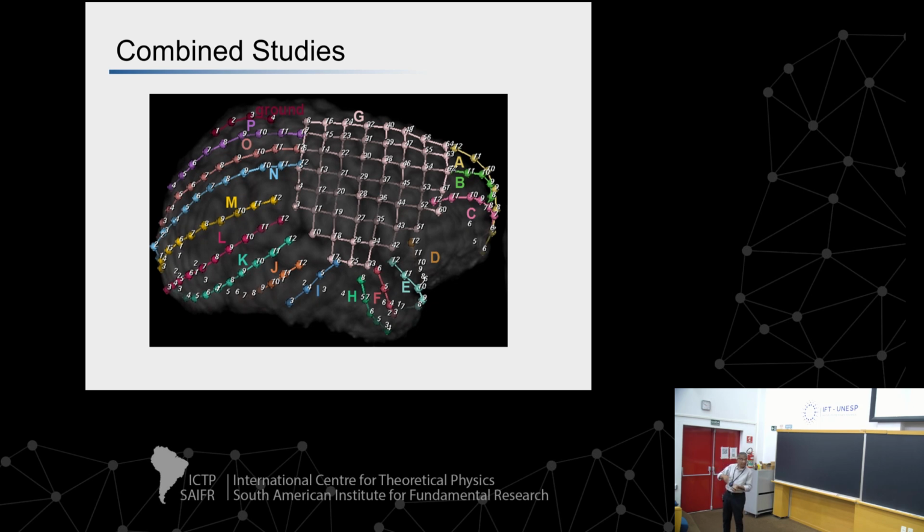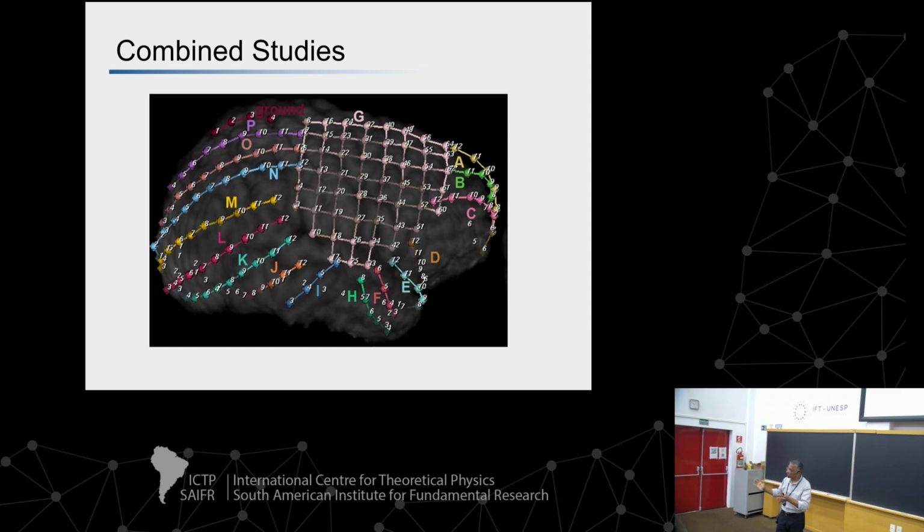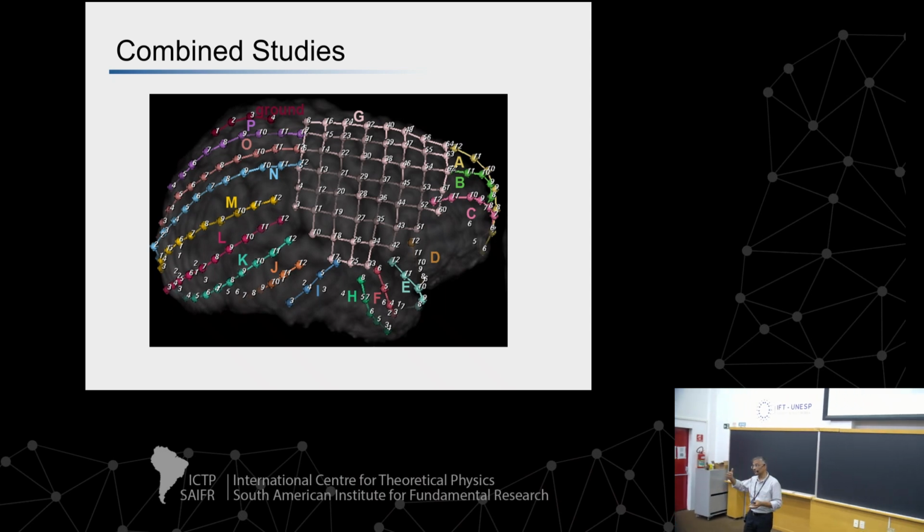And then once that opening's made, you can put in strip electrodes freehand. So all of these are strip electrodes going into the posterior parts, the occipital lobe, or going to this inferior temporal parts or the frontal parts. You place these electrodes, you close up the skin flap, you send the patient back to the ward, and then you record. You're trying to capture enough seizures to know where the seizure onset area is.